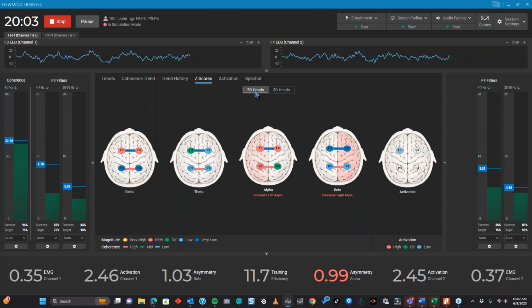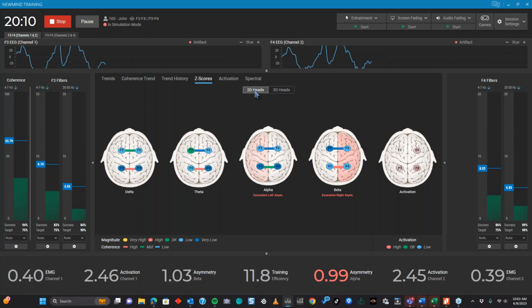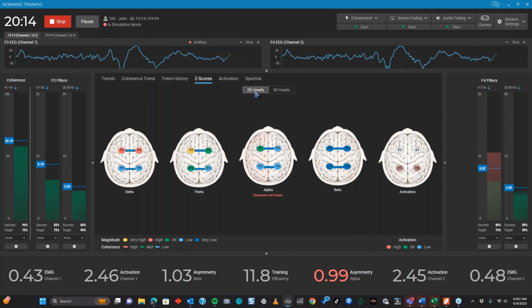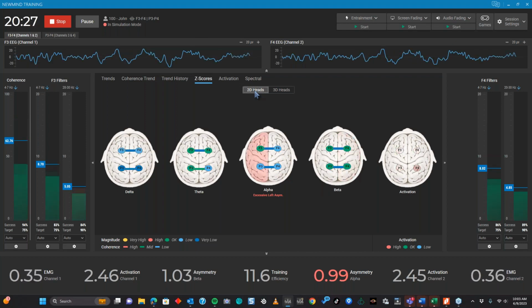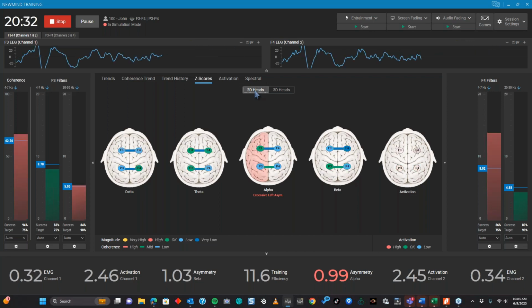Well, she shows up the day for the map, and she had slept about 4 to 5 hours in those 3 days. And the clinic called me and they said, "What should we do?" I said, "Tell her to go home, eat one of her gummies and go to bed. Get a couple good days of sleep and then reschedule her." And that's why we have the EEG and drug effects chart, for situations like that.